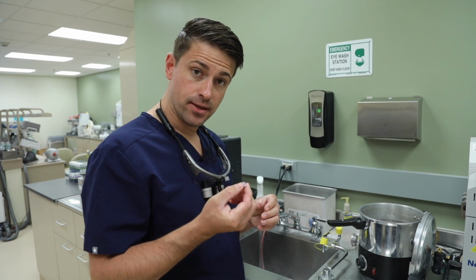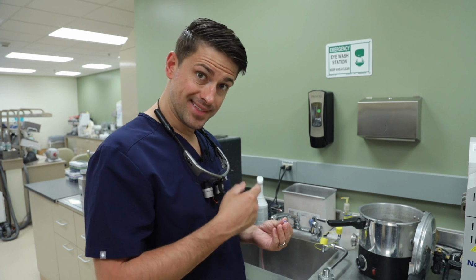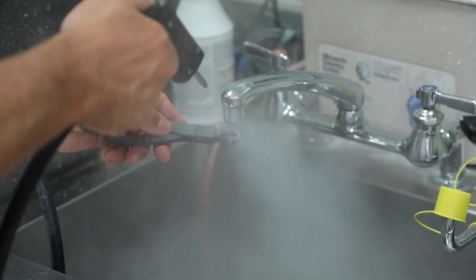All right, so after this thing comes out of the mill, sometimes it'll get some oils on it from the milling process, so I'm going to clean those off with the steamer real quick. The next step is going to be removing the sprue. After I get the sprue off, I'm going to get this thing ready to fire. So I'm going to use some object fix and a crystallization peg to get this ready. And then I'm going to use a dark stain to label the lingual side of this so I know what shade it is. And then we're going to fire this. After it's fired, we will do a separate glazing of the crown and a correction firing after that.